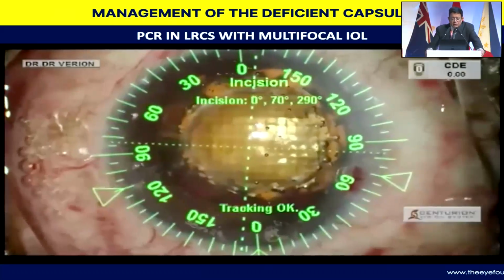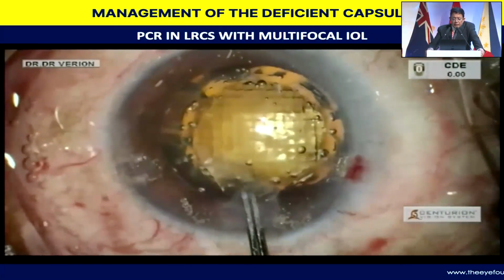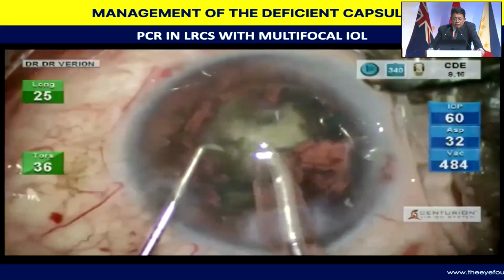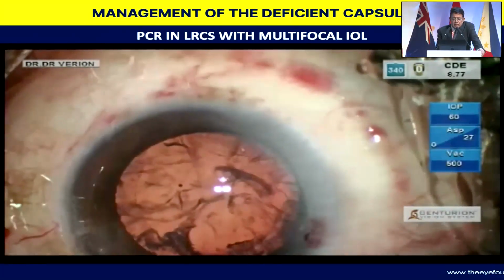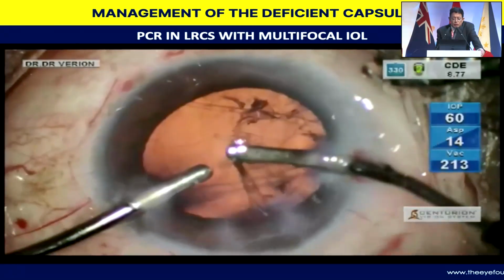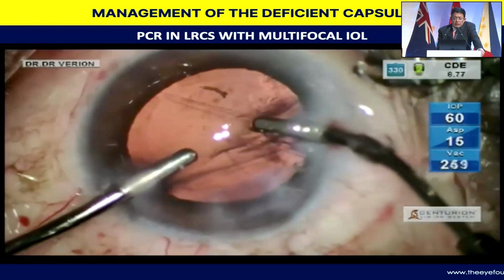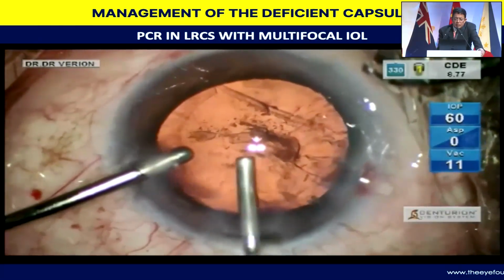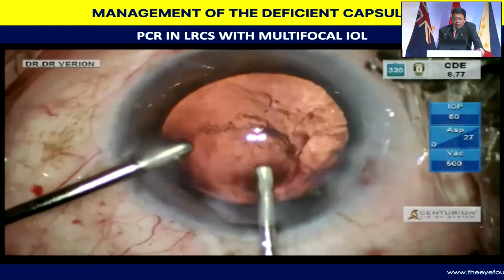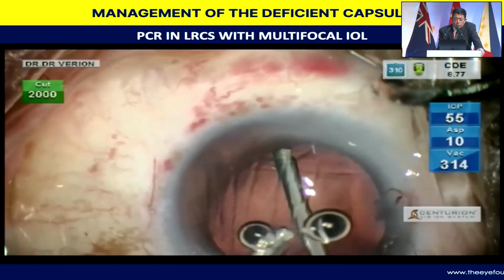This was a gynecologist friend of mine. One eye I had already operated on with a premium intraocular lens a week back. Fairly routine surgery, fairly dense cataract, and you can see that the first time I suspected something wrong was when I found that there was something floating in the anterior vitreous. And then you can see a small discontinuity at this 6 o'clock position, and this is the area of the PCR, but an adequate amount of posterior capsular support was available.